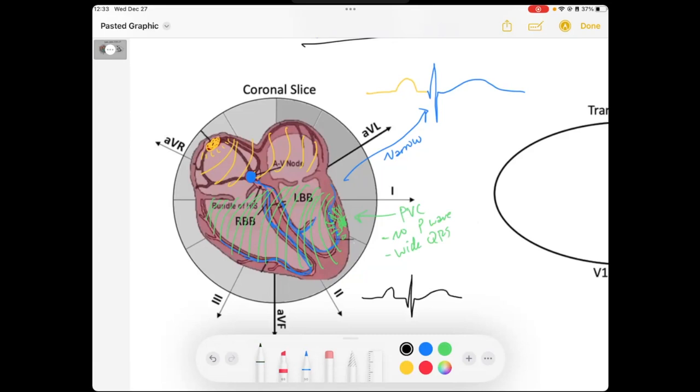And then you have an early beat that is this wide complex QRS. And then we've kind of got this funky looking T wave. And so this is our wide QRS PVC.